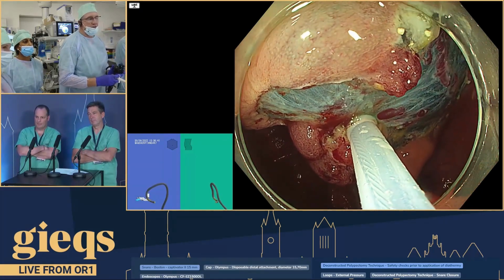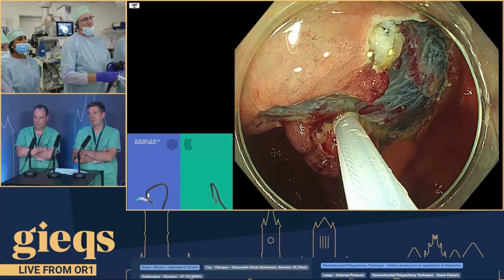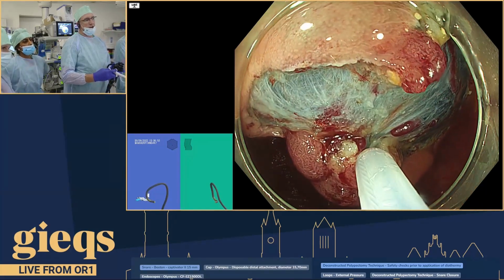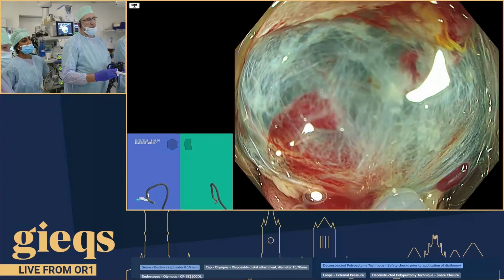And now the next thing is, it looks like we might have a bit too much, maybe not. It's hard to tell. What makes you think that, Michael? Is it just the way it's bowing? Yeah. And so what I do is I release, and then I recapture.